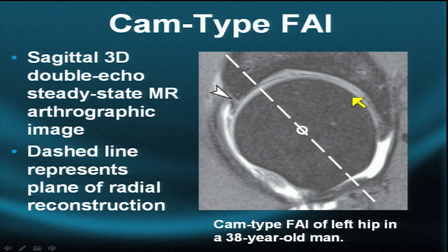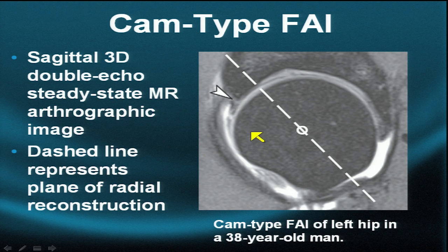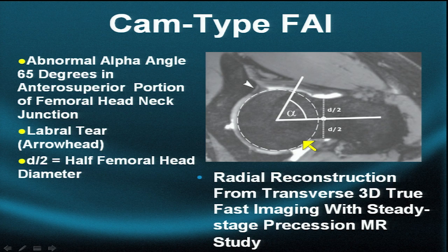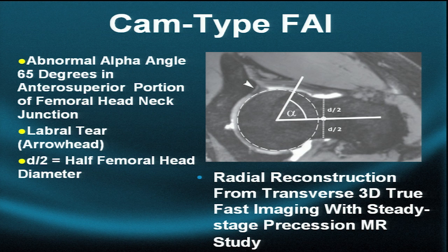Here's a sagittal demonstrating a labral tear in a patient with cam type impingement. The series of radial images will be obtained to look at the overall shape of the femoral head and neck — the dashed line represents just one of the many radial images that will be obtained. Here's an oblique axial image, which is used conventionally to measure the alpha angle.